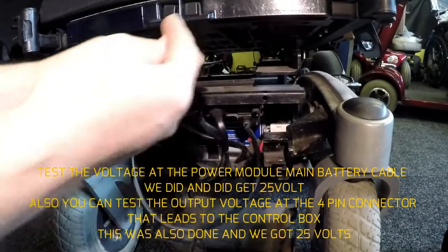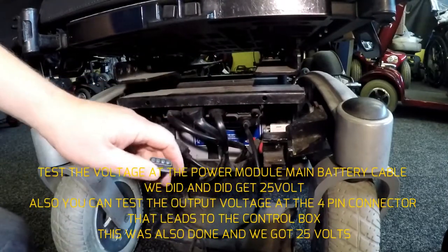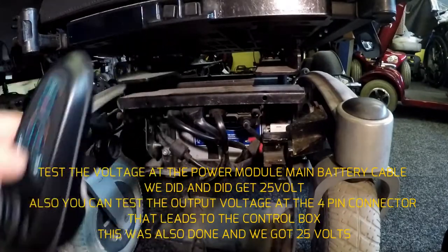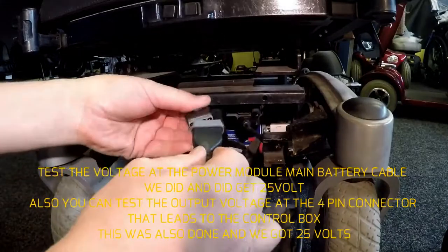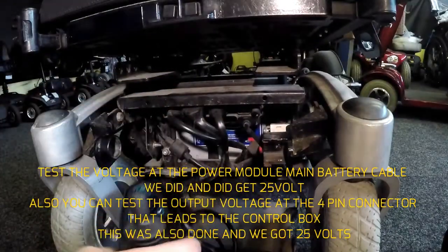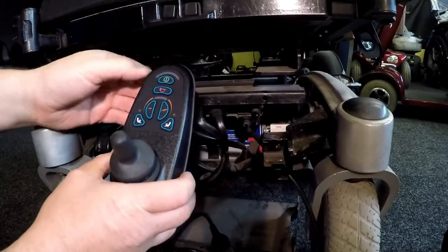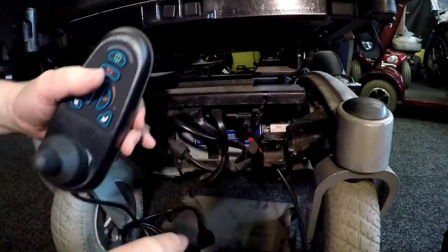Okay, I'm not going to put it back into that one there. I'm going to put it in my new joystick here, and join it together. We never know. Still a problem. So what's next?